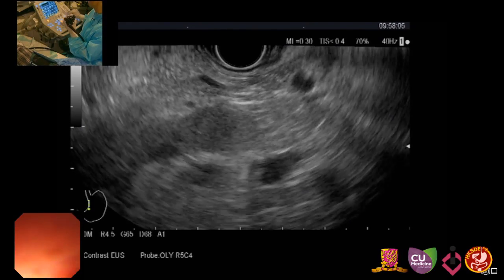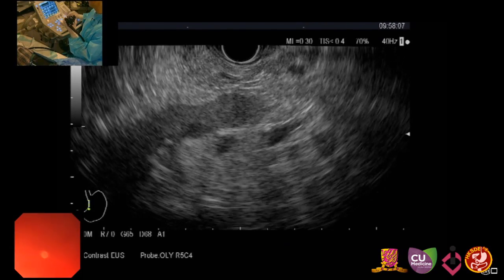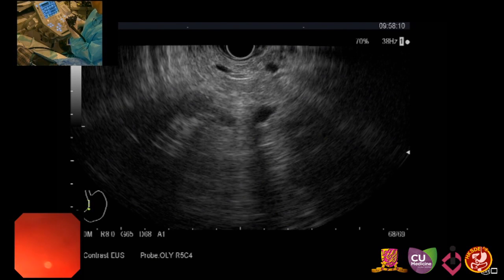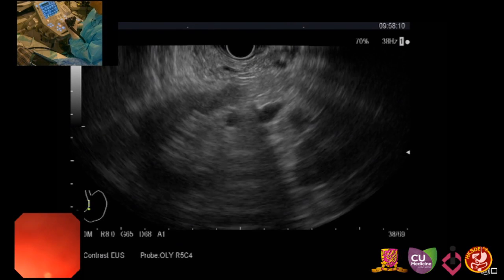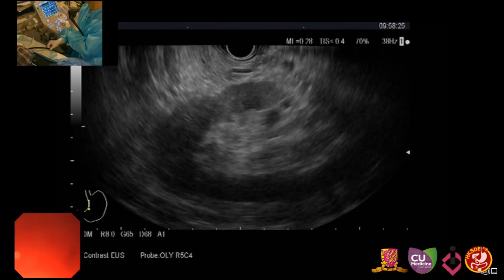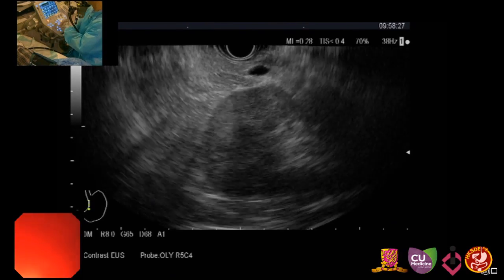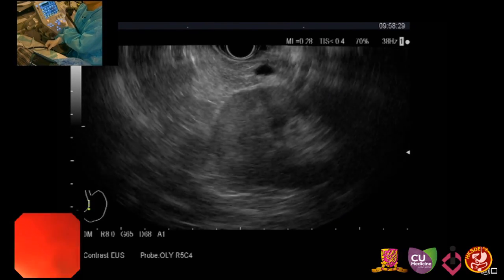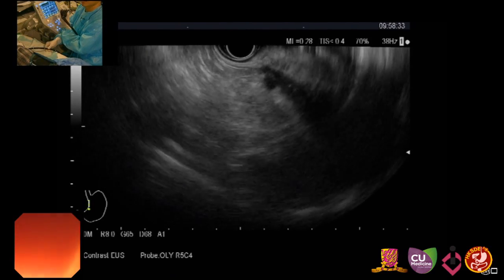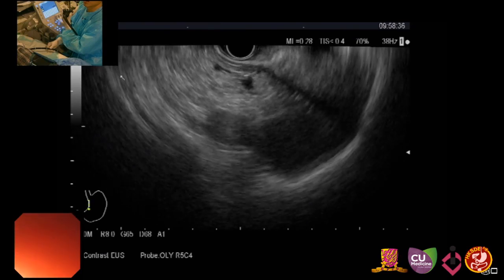If I zoom out, I can see the contour of the left kidney more clearly. We can appreciate the kidney cortex and medulla. If I rotate a little further, I will probably reach the spleen area. The spleen is at the tail area of the pancreas.